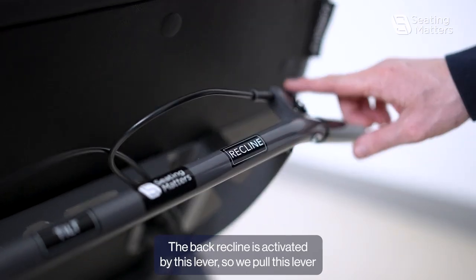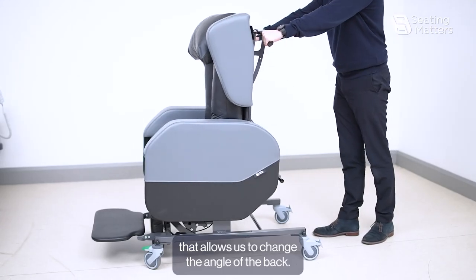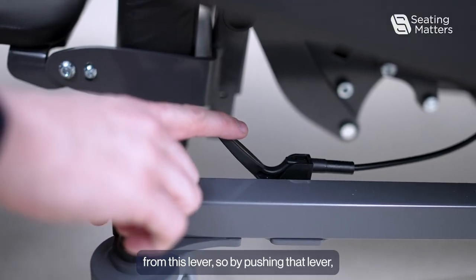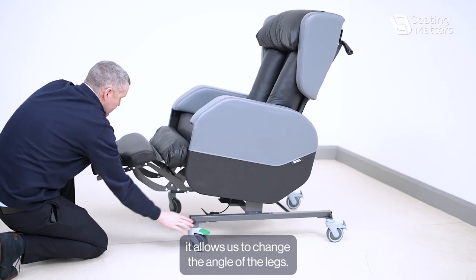The back recline is activated by this lever. By pulling this lever it allows us to change the angle of the back. The leg rest elevation is controlled from this lever. By pushing that lever it allows us to change the angle of the legs.